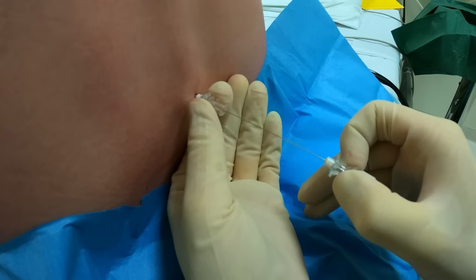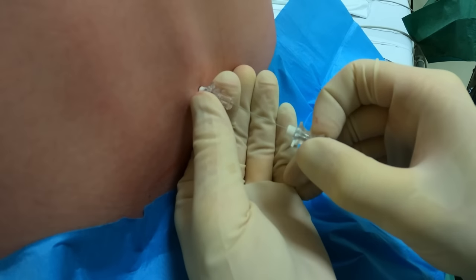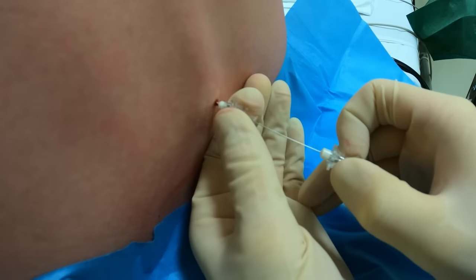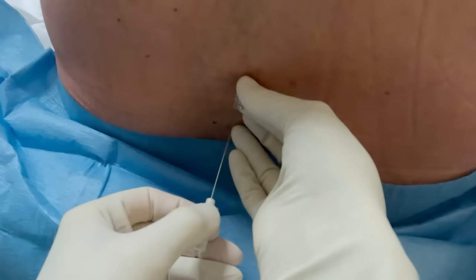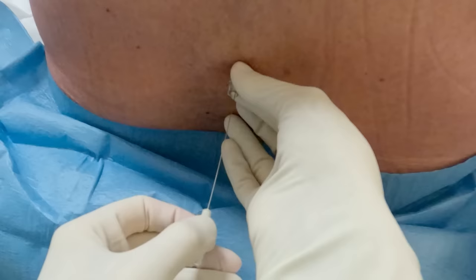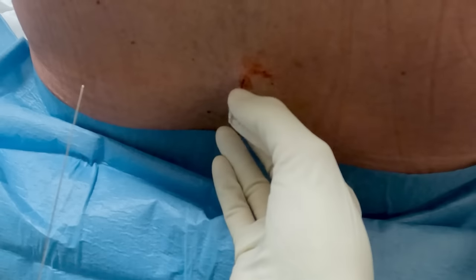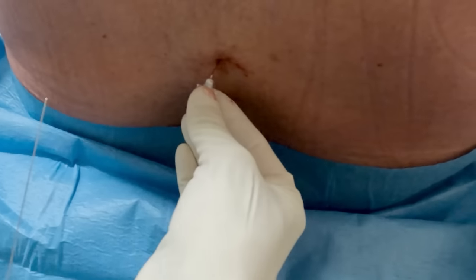Have you ever experienced or witnessed a difficult spinal puncture in a young, slim patient with landmarks visible from a mile? In these cases, no matter what you do, you always seem to hit the bone. I will dare to say that most struggles with spinal anesthesia that I have witnessed were actually in skinny patients with easy landmarks.